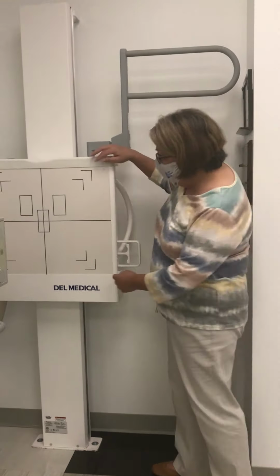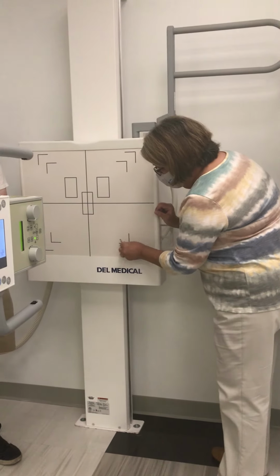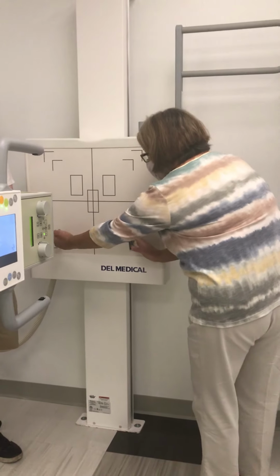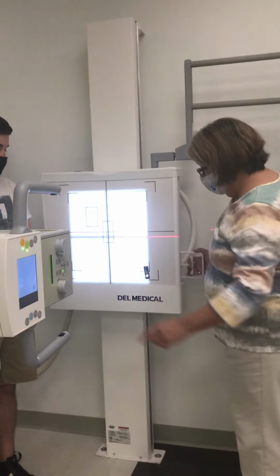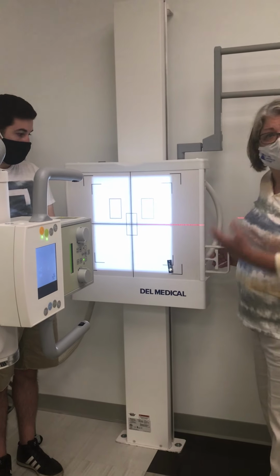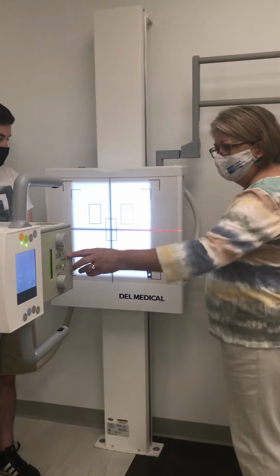So we know our light field is going to be 17 inches long, and we know it's going to be 14 inches wide. So if we place that marker right here within that 14 by 17 inch dimension, our marker is going to be in the light field. Sure enough it is. But you don't even have to worry about centering at this point.